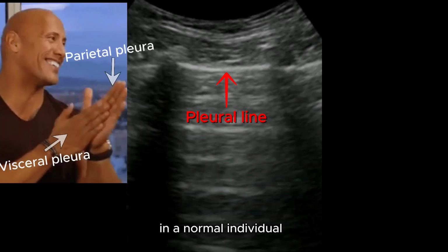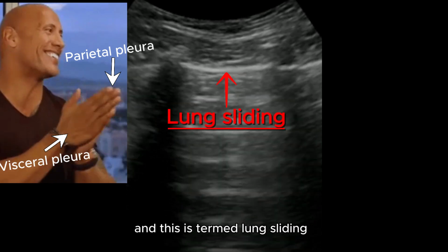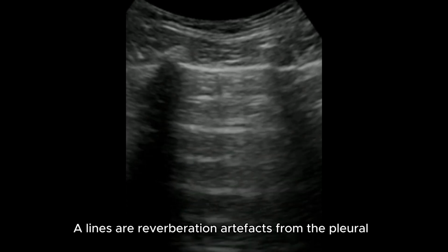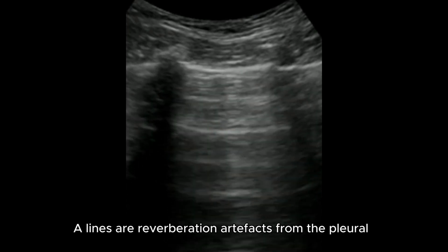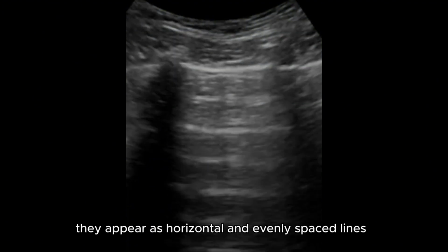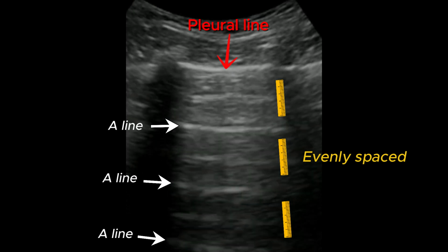In a normal individual, the visceral and parietal pleurae are sliding, and this is termed lung sliding. In addition, we may notice A or B lines. A lines are reverberation artifacts from the pleuro-pulmonary interface, and these can be seen in healthy individuals. They appear as horizontal and evenly spaced lines beneath the pleural line.